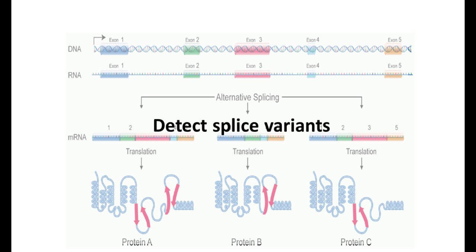Now here's an example of how these researchers used the RNAscope assay to identify the delta 16 HER2 splice variant in breast cancer and other tumors. So the probe design strategy that they employed was they designed a probe that spanned exon 15 and exon 17 of the HER2 transcript. This would allow for detection of only the transcripts that had exon 16 missing. That way, they could detect the delta 16 splice variant.